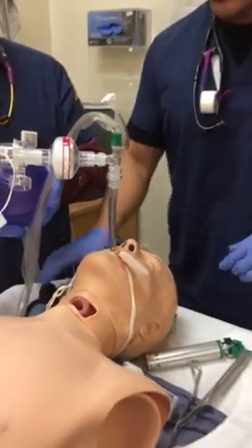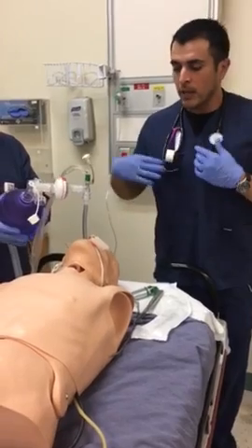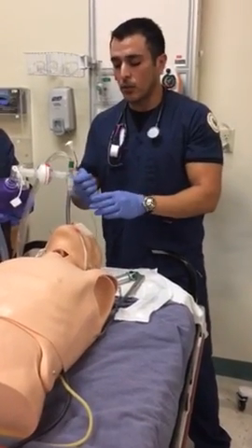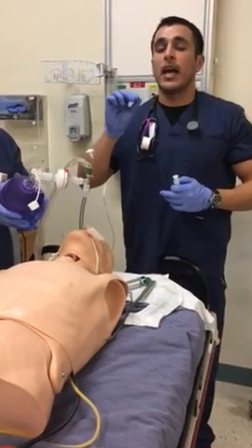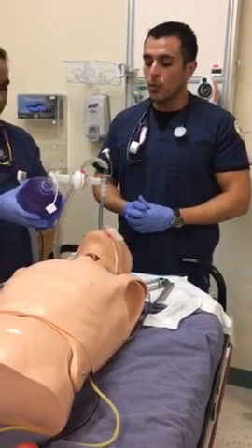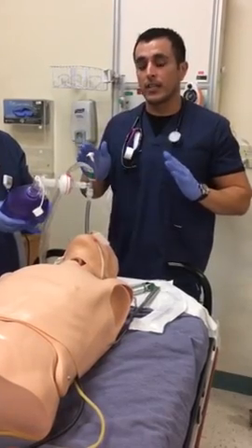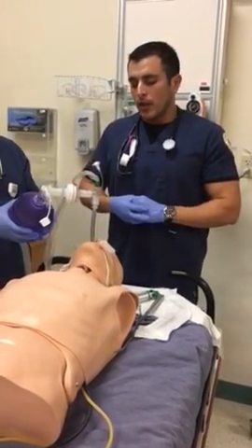There are 2 other ways to test the cuff pressure and to make sure that it's adequate. With our stethoscopes, listening to the airway, we could take air out while it's inflated and there's no leak. We could take air out slowly until we just barely hear a leak, and that would be the minimal leak technique. And then the other way is when you do hear that leak, you could put air in slowly until the leak is no longer audible, and that would be the minimal occluding technique.